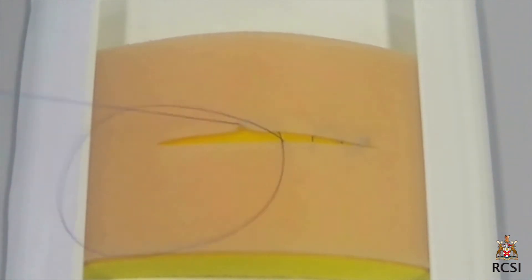Care is taken to the left side of the wound. You can tighten the suture after every 3-4 bites.